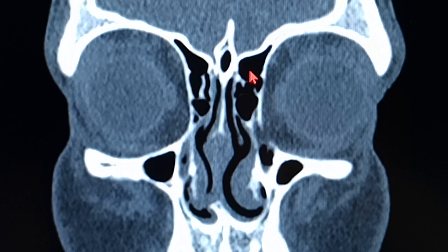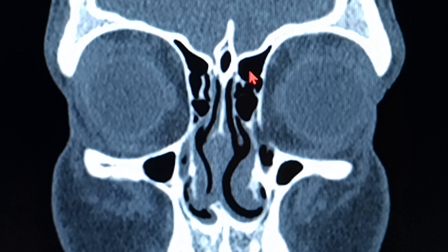If it is anything less than that, less than 1 or less than 0.7 centimeters, it is going to be really difficult. Okay, so you can estimate before your surgery the dimension of the frontal recess, because if you're going inside the patient in the OR, and if you are just damaging the mucosa around the frontal sinus opening, trust me, that area is going to undergo fibrosis, and if there's any raw bone exposed because of all the mucosal damage, the patient will have a long-term frontal sinus blockage that is called iatrogenic frontal blockage, which may lead to either mucocele or infection in the frontal sinus later on.